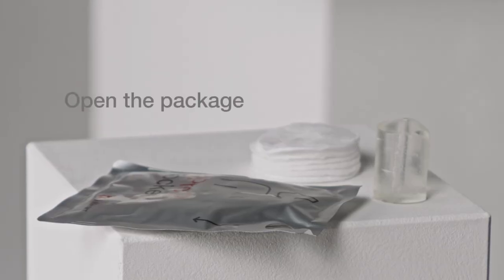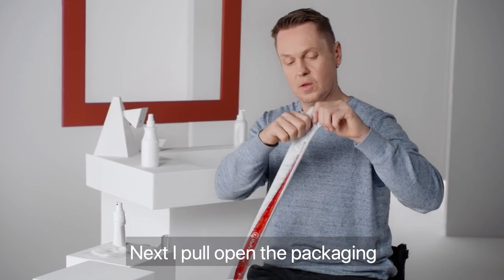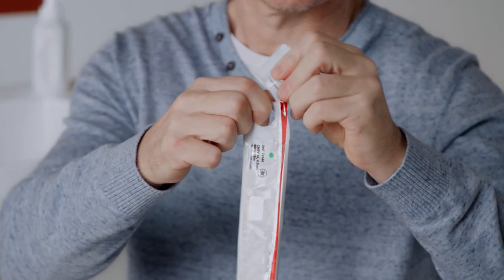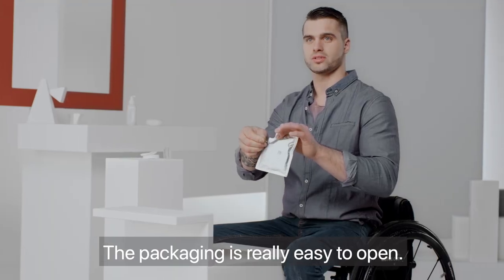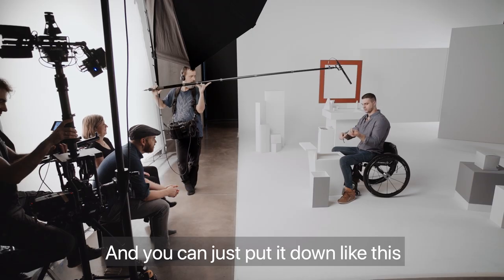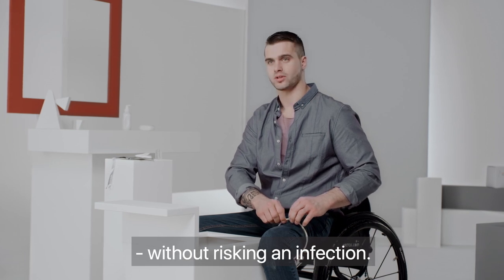Now open the package. Pull the top finger hole toward you and pull down to open. It's really easy to open — it takes two seconds and it's super easy. It's a product that is well protected, so you don't have any problems with infection.